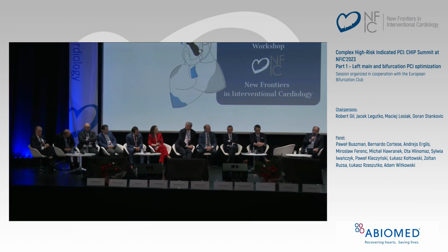First, I would like to thank you for this great review of the current studies on the current technology for left main bifurcation and stenting. We learn a lot from all kinds of imaging, and of course sometimes we may decide that QCA may be enough based on our previous experience, having done many IVUS or OCT studies.